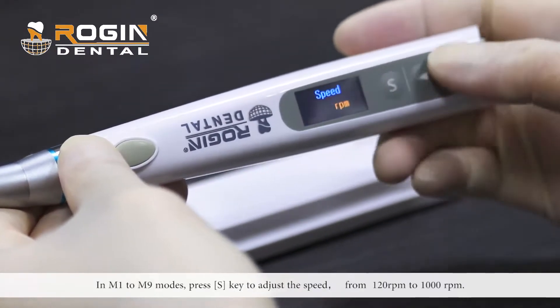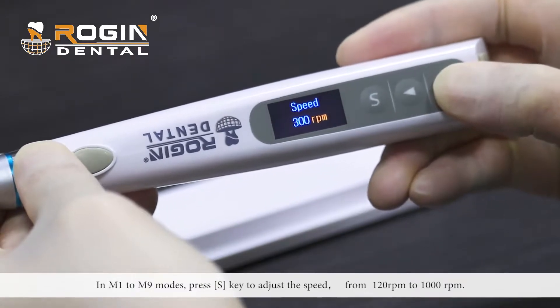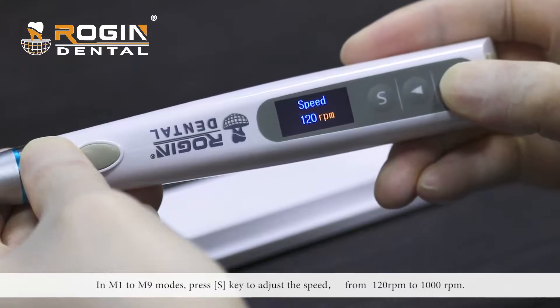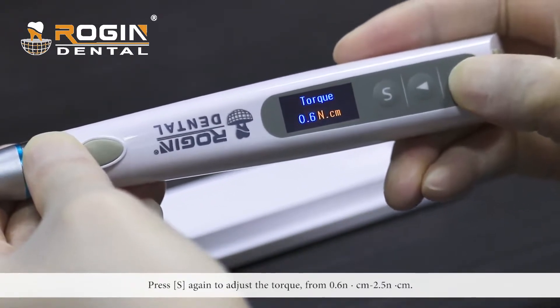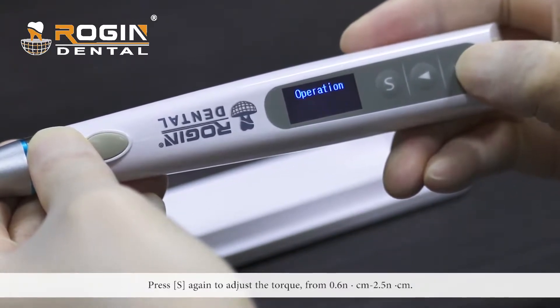Modes include M0 reciprocating mode. In M1 to M9 modes, press the S key to adjust the speed from 120 rpm to 1000 rpm. Press S again to adjust the torque from 0.6 to 2.5 Ncm.